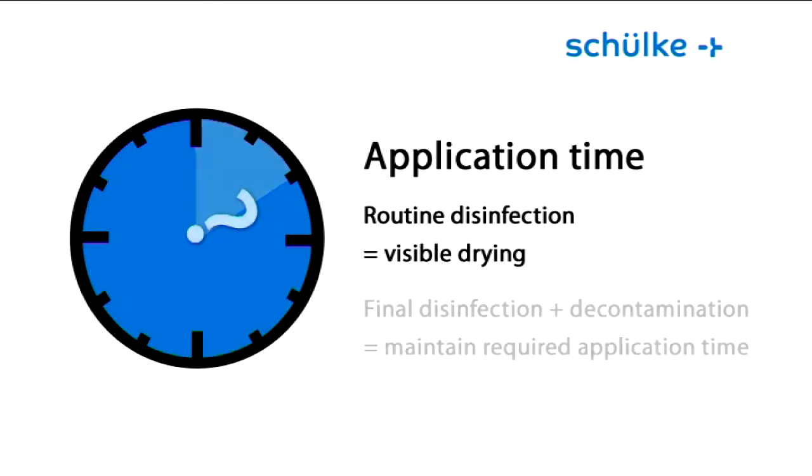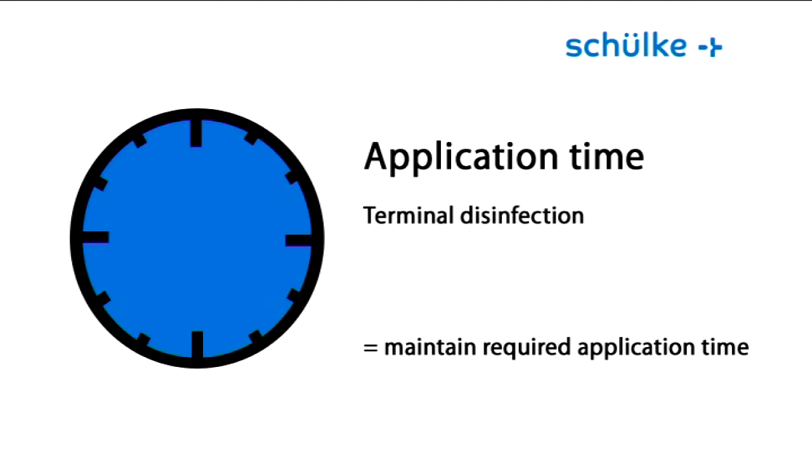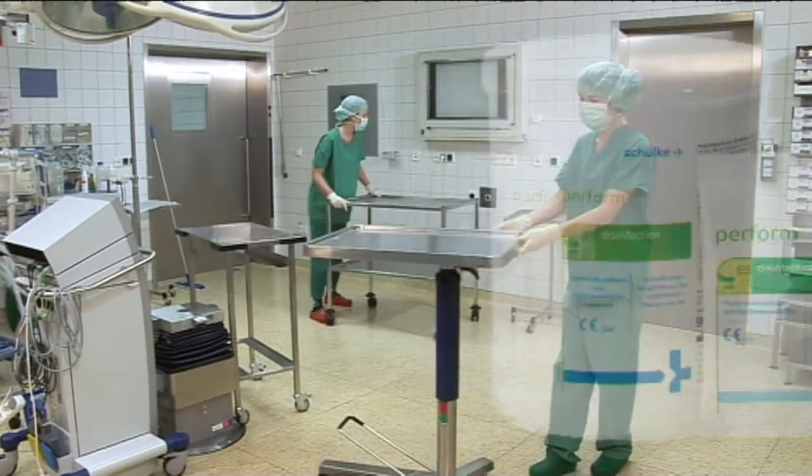As we are talking about the final disinfection, the concentrations and application times have to be strictly followed according to the manufacturer's advice. The required application time must also be maintained with officially ordered final disinfections. Only products and procedures approved by the local authorities may be used, in particular in case of any outbreaks. Oxygen-based products like, for example, Perform, offer the most comprehensive spectrum of microbial efficacy.